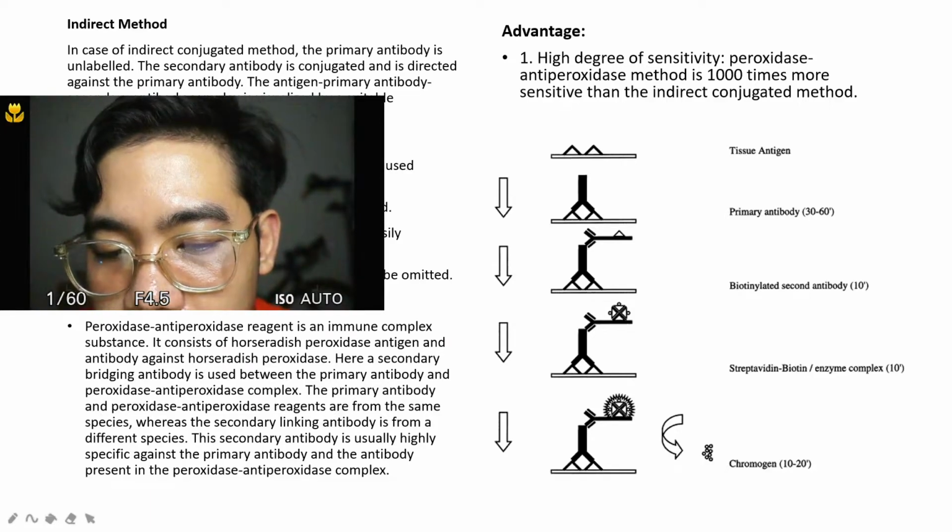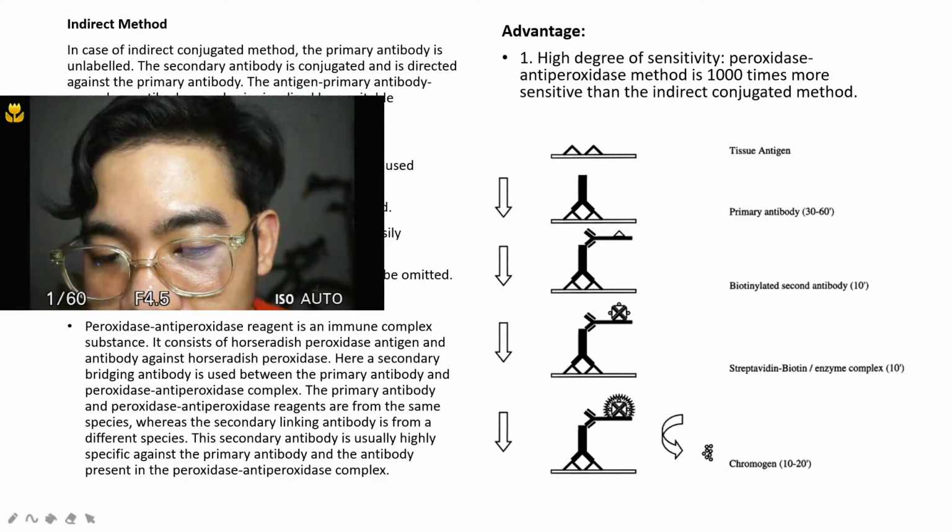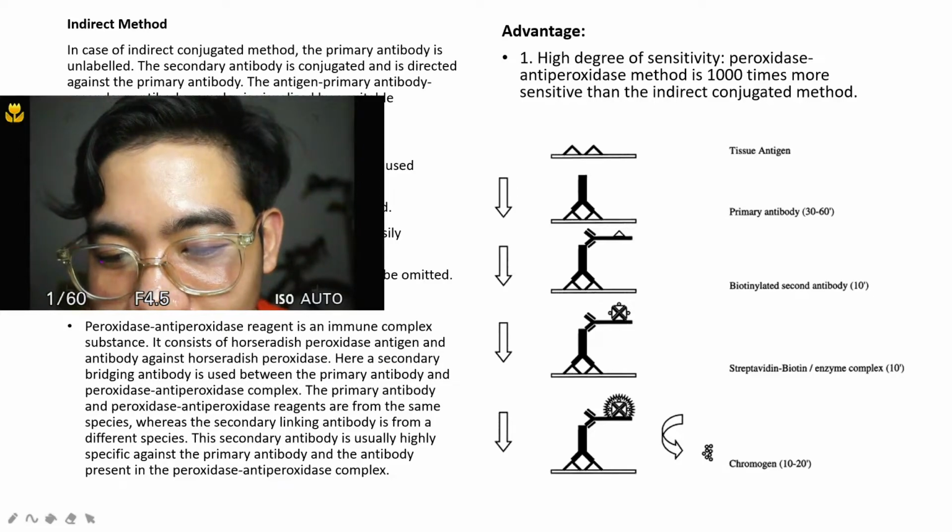Always remember, even though it stains, as long as the attached antibodies are not clustered together, it is not discernible. It's quite faint.